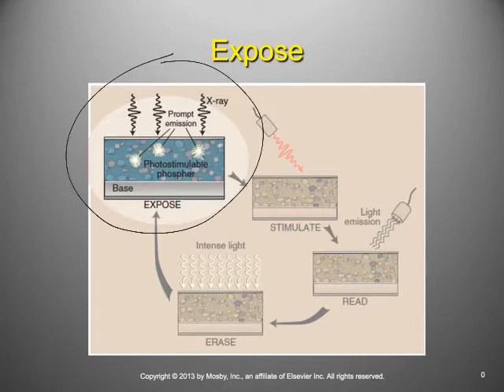We come back 4 hours later, develop our image. Chances are it's not going to be as good of an image as it would have been initially when we first took it, okay? Because we lose some of it, it fades. In roughly about 8 hours, it's completely lost.